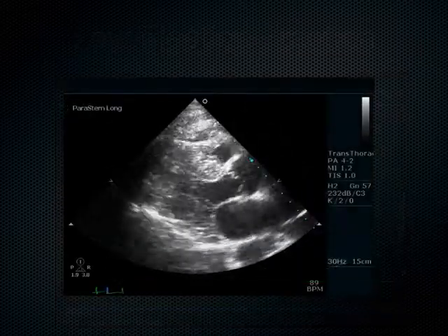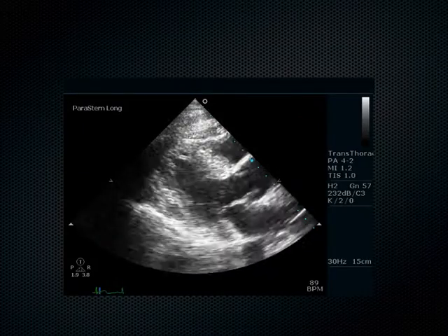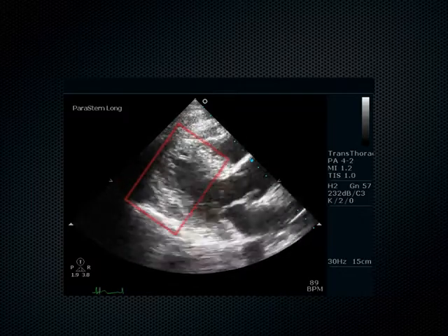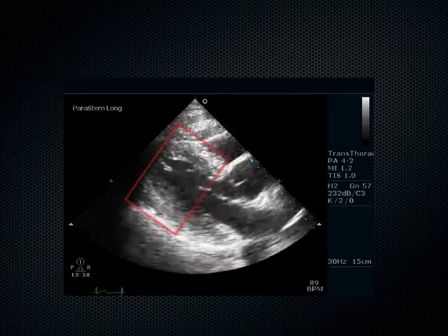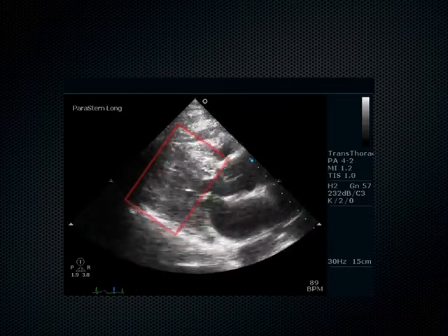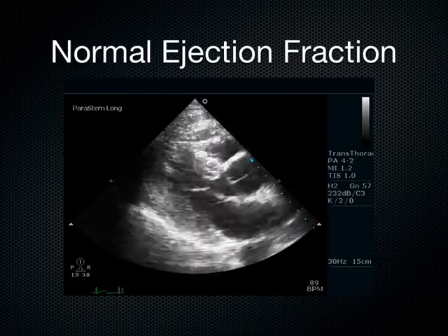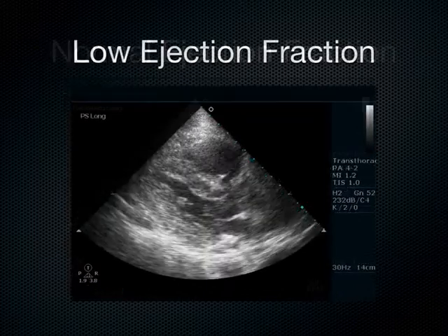How about this next one? Okay, septal leaflet coming up. Pretty good, hitting that septum pretty well. Okay, good sequentiality going on. How about the LV and the septum, interventricular septum? Yeah, the heart is emptying with each beat. See how they actually touch each other there. And when they touch each other like that, and this patient's blood pressure is 70, I know that I need to right away get some fluids going, right? This is a dry heart. It needs some fluids. A normal EF, that's a very thirsty heart.